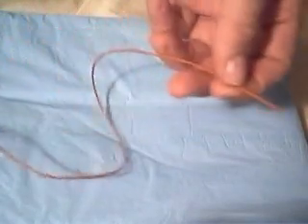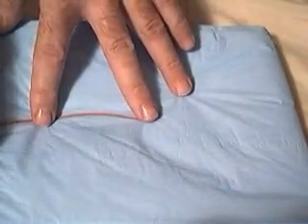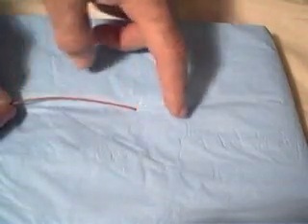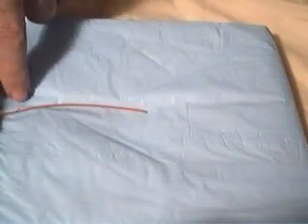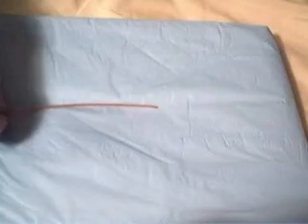It has an end to it, a soft round end, which I'm going to use to measure against the puppy. Because when we insert this into the mouth, I want this part of it to go into the stomach. So we're going to measure against the rib cage, and we're going to find that it's going to come out to a little spot, and we're going to mark that with a pen.